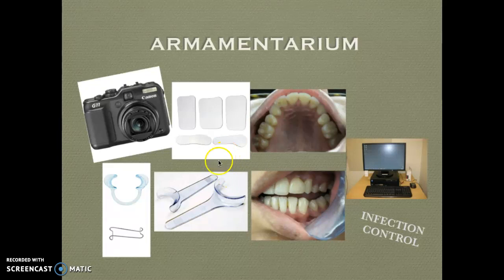The mirrors and the retractors should be rinsed to remove any saliva, dried thoroughly, and then packaged for sterilization, so they can be placed in an autoclave.